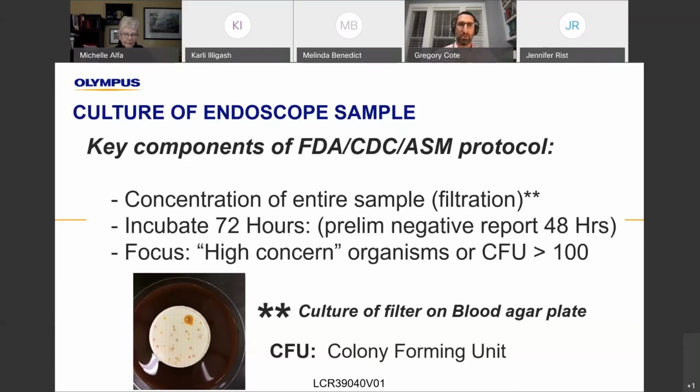So I think personally, if you really want to make a commitment to this, it really should be a true random sample intermittently throughout the week, at different times of the week, and then we'll talk about how to handle the duodenoscope, or any other endoscope that you're culturing, during the process of waiting for results. But ideally, it's done at random times of the week, so that you have a true quality assessment, quality assurance program on your reprocessing program.